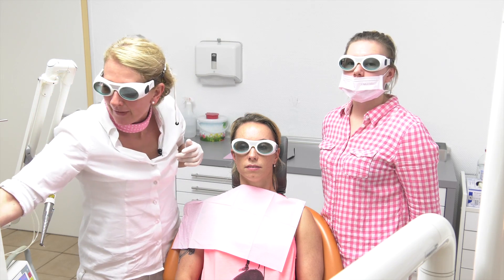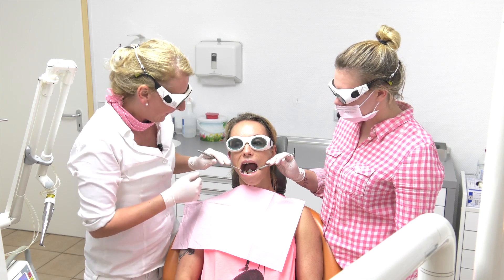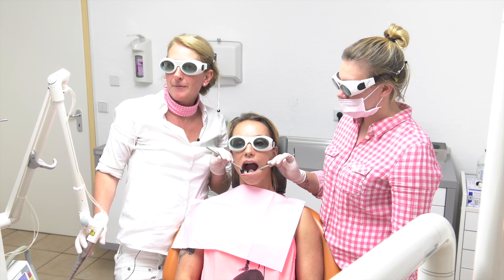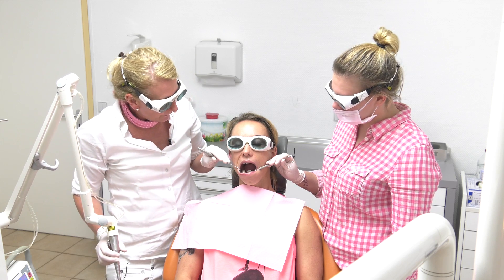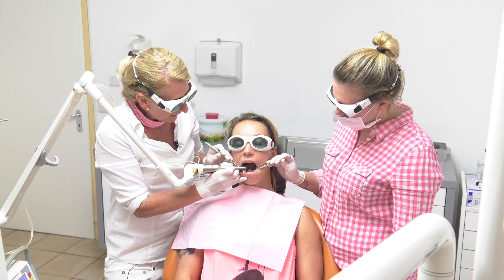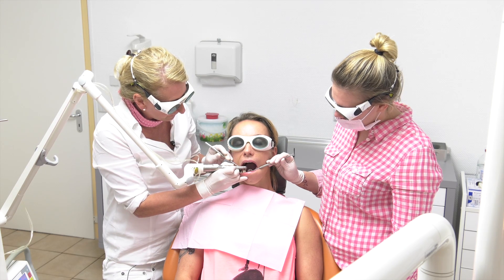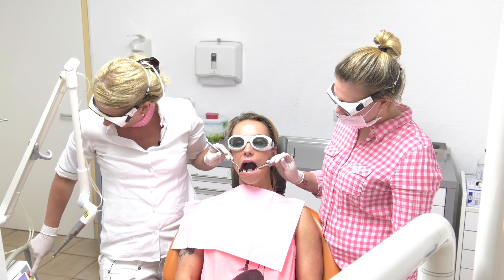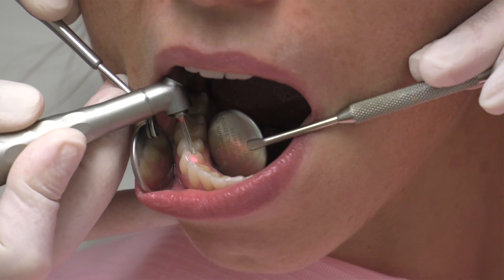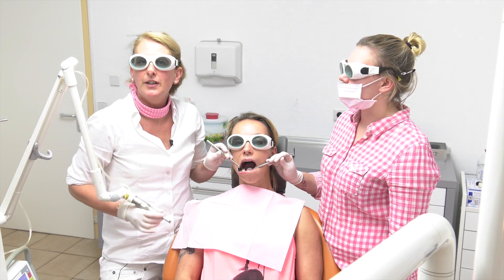And now we do the conditioning — could you please open your mouth, Ellie? We use the solid-state laser, which works with a wavelength of 2,940 nanometers. You can follow along that by doing the conditioning on the surface, it works very, very fast. I hope you can see it well. And the conditioning is already done.